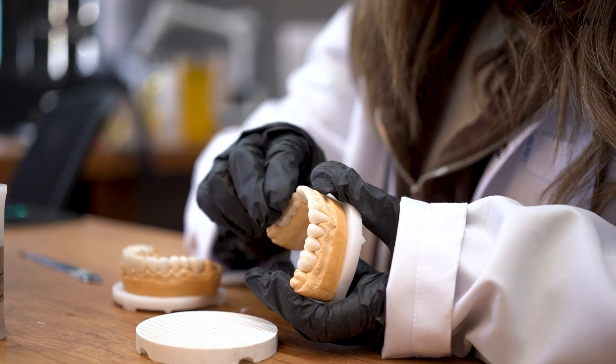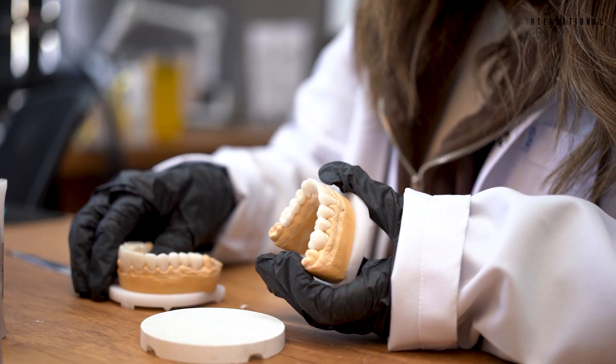Hello, this is Cenk from International Plus Dental Laboratory. We are the backstage team of the work here. While you come to the clinic and get your process started after taking the measurements, that's where we step in, while you reach your new smile in a few days.